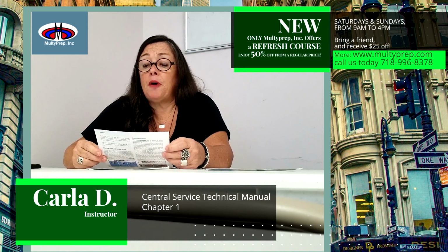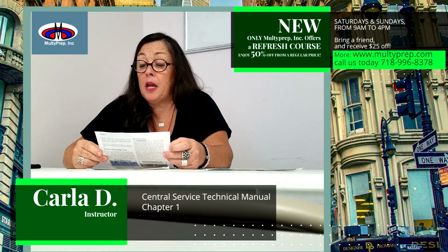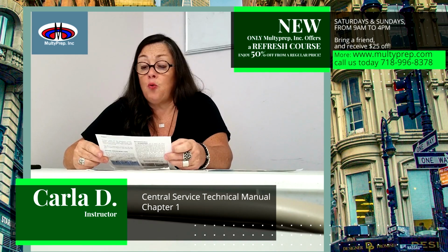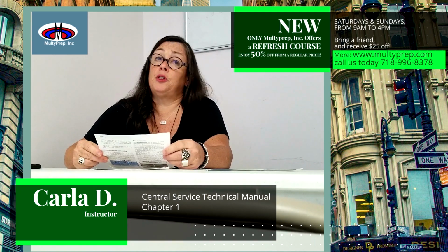Centralized management helps provide maximum utilization of human and material resources. This eliminates the costly duplication of processing equipment, utilities, space, and personnel. Educated and skilled central sterile technicians must be knowledgeable about the complexities, precautions, and techniques required for their job. They must carry out tasks in a manner that protects the welfare and safety of patients, co-workers, themselves, and their community. Proven material handling techniques are employed to provide high levels of efficiency.